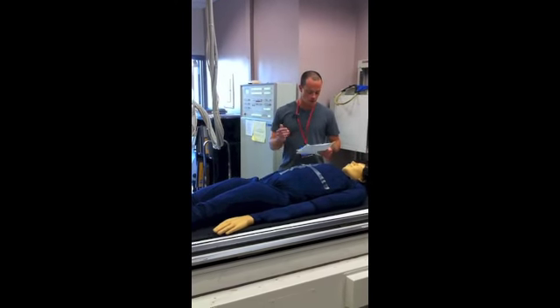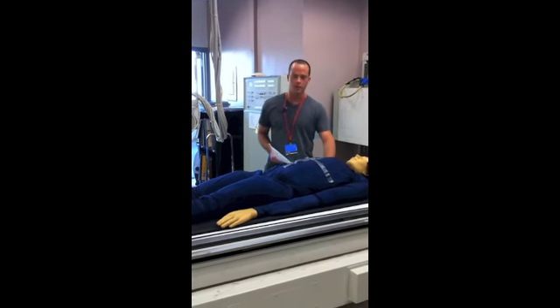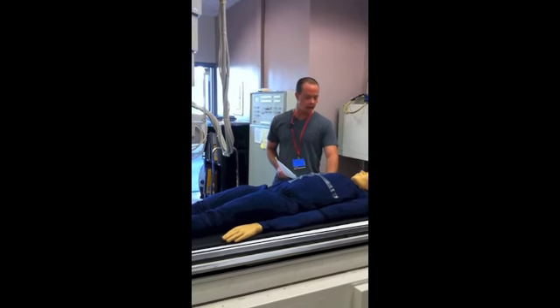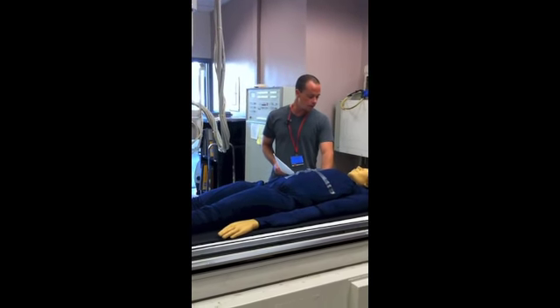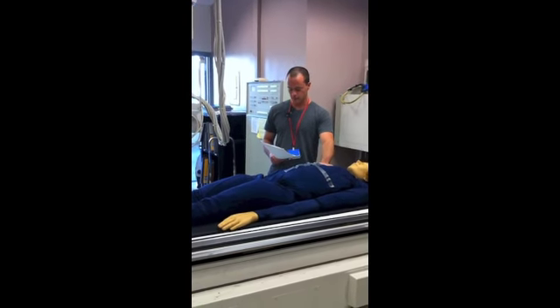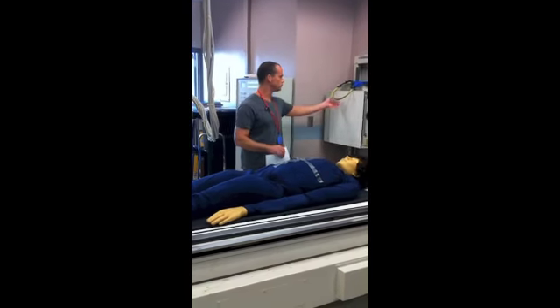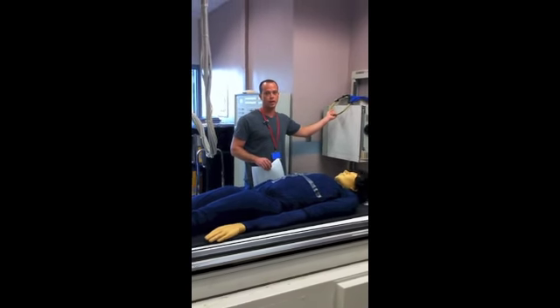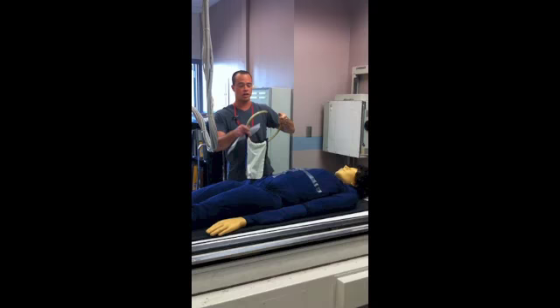We're going to have the patient change into a gown and obtain the patient's history, ask them the onset and how long it's been bothering them, the problem, and anything else I should know about that. So here's where I have the patient change into a gown. The patient is changed into a gown. I like to leave my shield right here when I do chest x-rays to make sure I don't forget. I'm going to shield the patient.